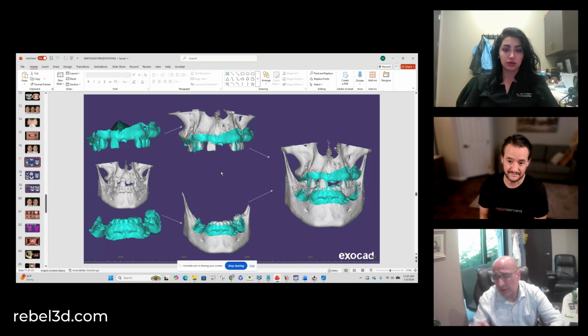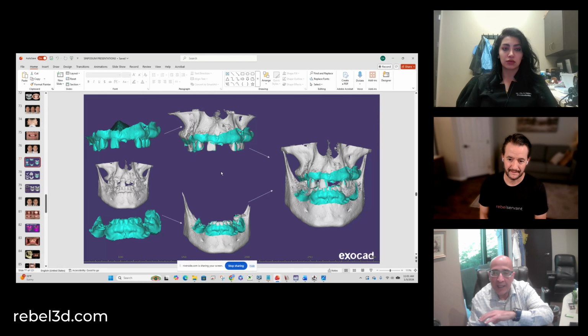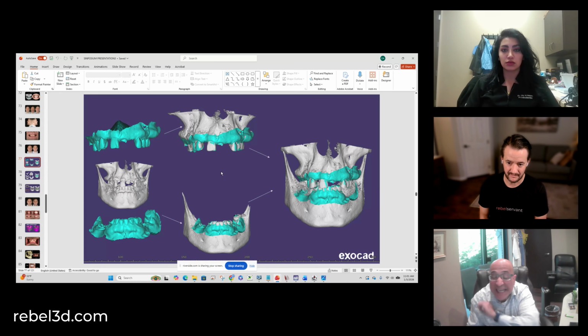Correct. And actually, we started this technique almost 3 years ago on a CT scan machine that I already had for 2 years before. So basically, it's a 5-year-old machine. When I bought it, the best was 175 microns accuracy for the CT scan machine, and it's still working excellent for me.